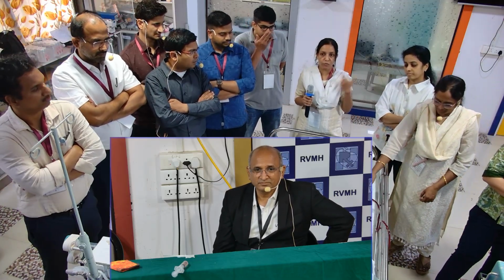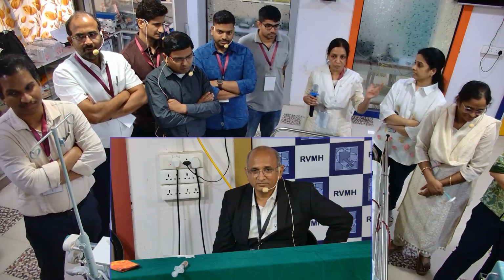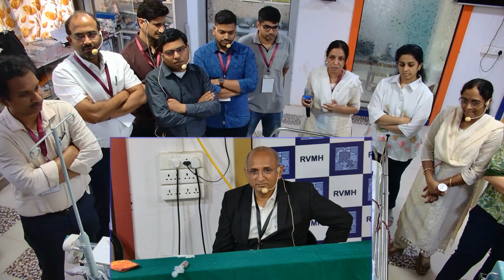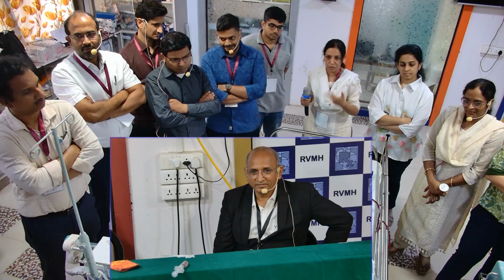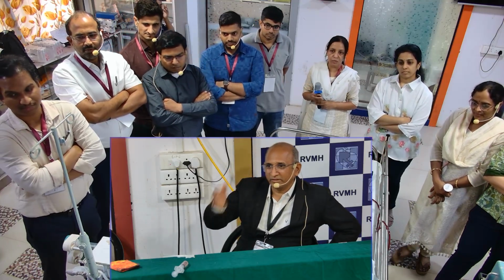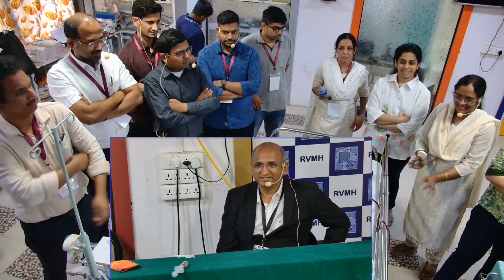Sir, all the pressures have to be monitored. We couldn't find the cause, sir. So we saw the pressures also and thought of changing the oxygenator as well. So Malav, you should have a definite sign before thinking of changing the oxygenator. We were keeping it ready, sir, just in case.